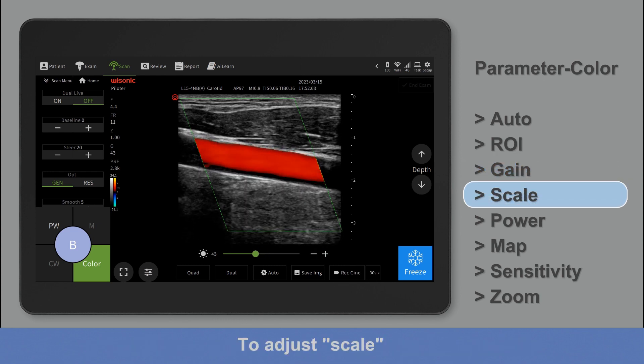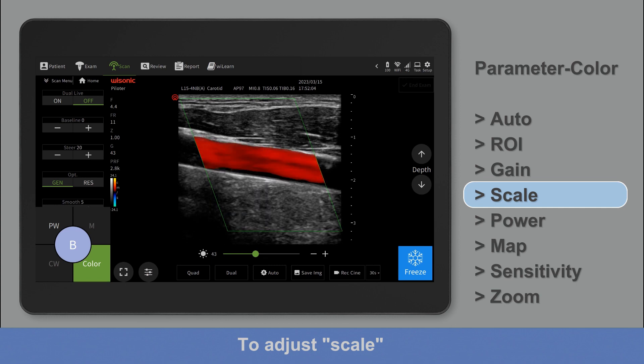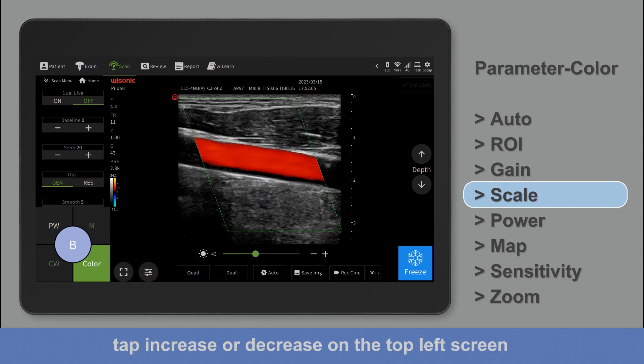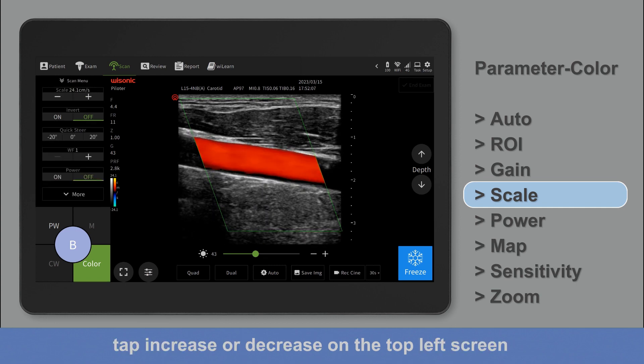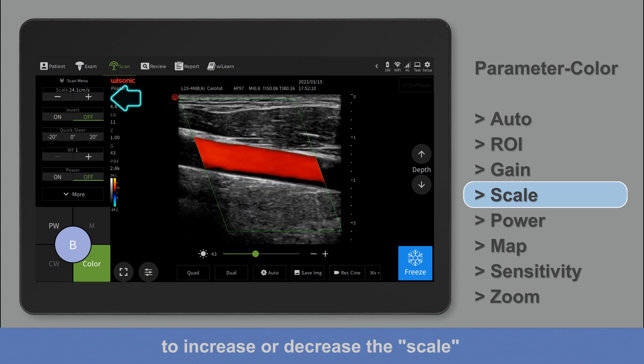To adjust scale, tap increase or decrease on the top left screen to increase or decrease the scale.